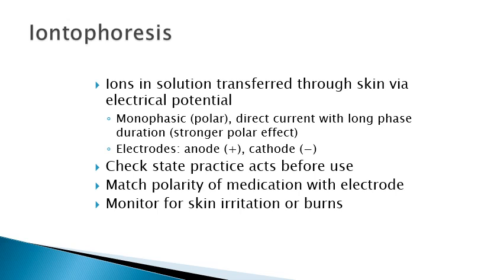If by chance they do get some irritation, just don't reapply it over that same area. If they just have a small blister or something, see if you can move the pad away from there, at least until that heals. But usually you don't get too many issues with that. They also recommend about 6 inches between the active and dispersive electrode with the iontophoresis units. So that's something to consider as well. Put them about 6 inches apart when you're setting up the patient.